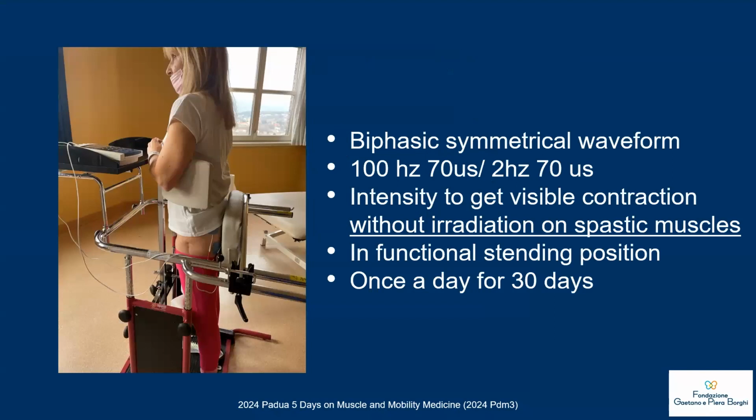We stimulate the extensor hip muscle, but we have some problems, because, unlike the quadriceps, which is very easy to stimulate, the gluteus zone is particular because of the thickness of fat, and the sensibility sometimes gives an unconfident stimulation. The impulse can hurt the patient in the region.